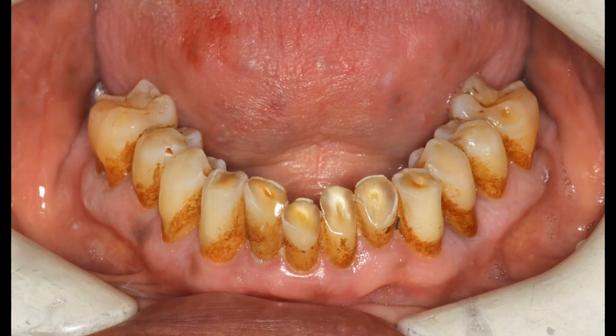Here you see some pretty significant wear of his lower teeth, meaning that he grinds his teeth. This was an ongoing problem for this patient, not just preoperatively, but during the use of his temporary bridges. He was in pretty frequently for repairs, and when he was here, I could even hear him grinding his teeth during waking hours, just in the middle of the day, even at his dental appointment. And it was no wonder he did have problems with breakage of his temporaries, that is.